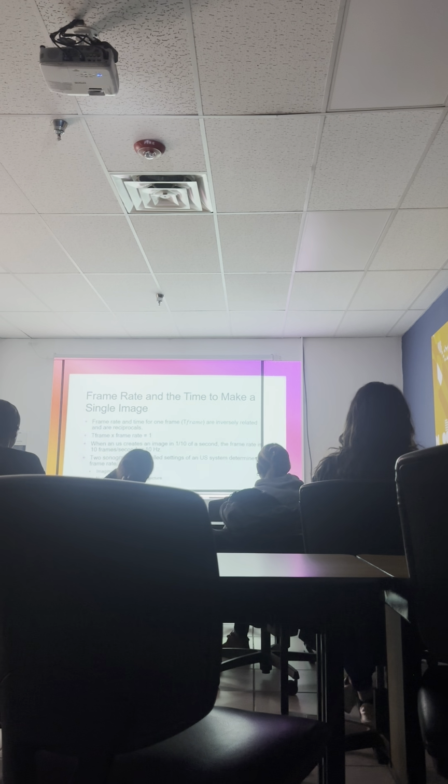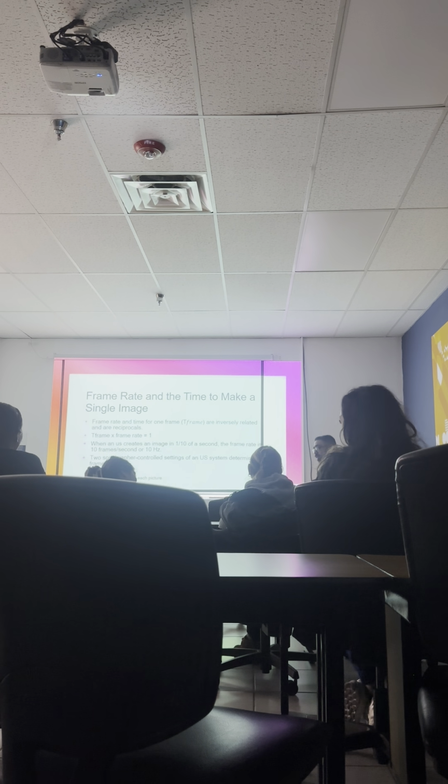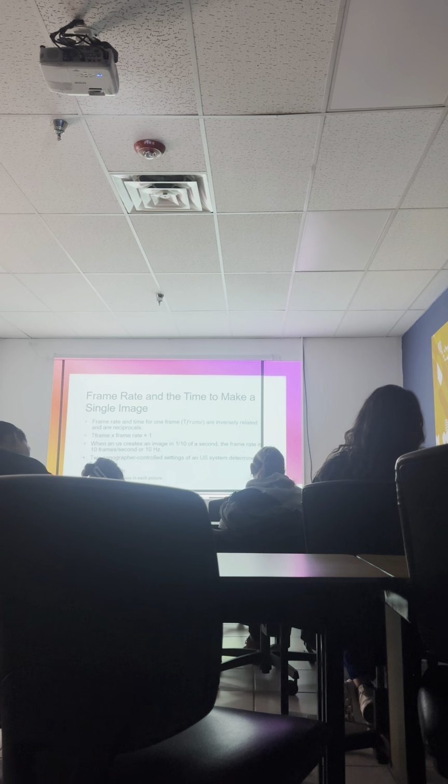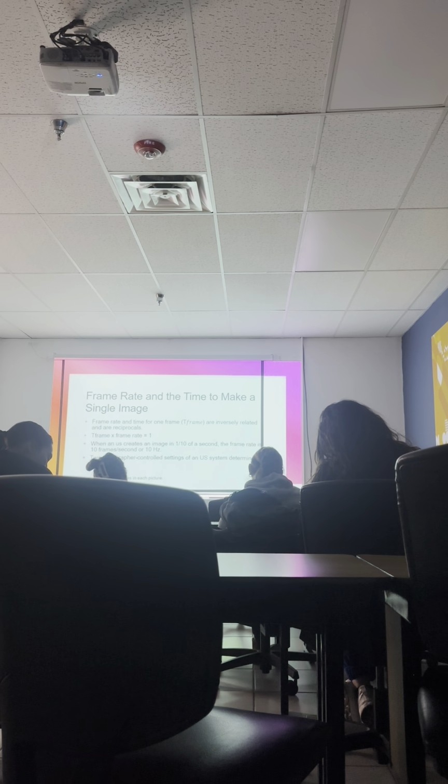Seconds, and that has to be like a shorter time is like a shallower image, and a longer time is a deeper image. Okay, so when it comes to T frame, a deeper depth or longer distance means a longer time to make that one frame. So they're directly related.